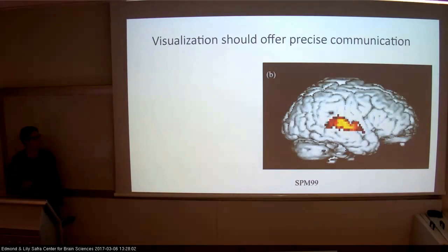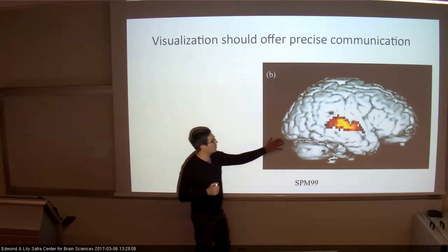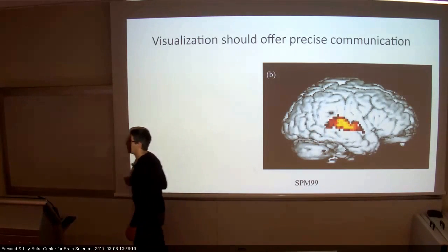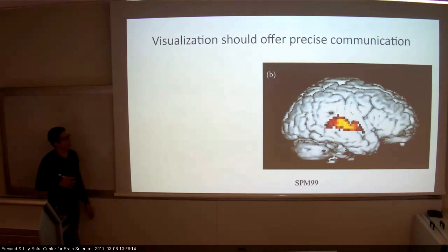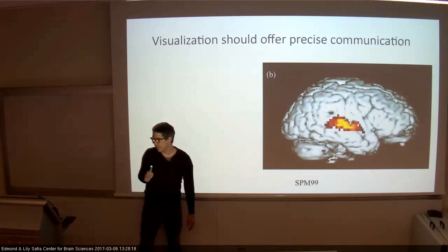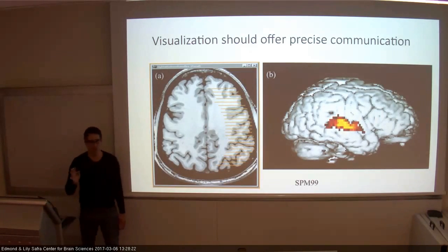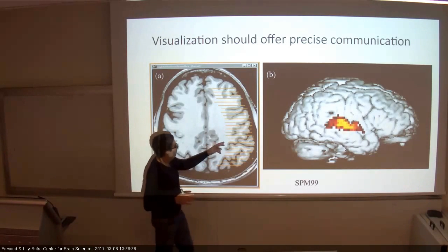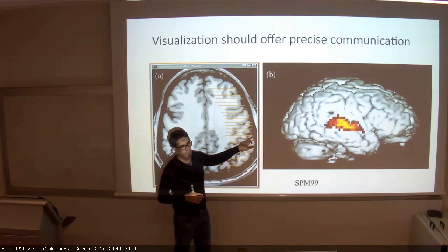Okay, so sometimes we see this kind of image in fMRI. Something is projected to the outside, not like in here where we actually respect the folding. In here, something was just projected outside. What does it mean? It means there was some kind of experiment, there was a difference, and then they found it somewhere along this line, and they just project it outside to the image.